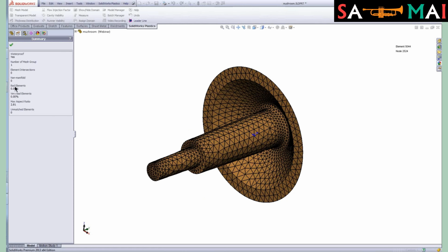And two of the key elements here based on the mesh are bad elements or very bad elements. We have some guidelines for the maximum values that you would want to see in those boxes.